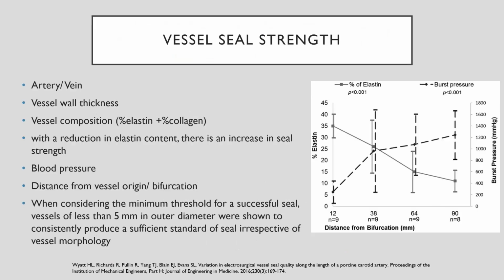It is very important to understand the concept of vessel seal strength, because this is what you will be looking at. Ultimately, this is what you want when you are choosing to use a vessel sealer. It depends on many factors: what type of vessel it is, whether it is artery or vein. Arteries have a better seal than vein.